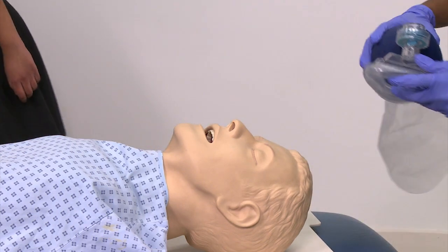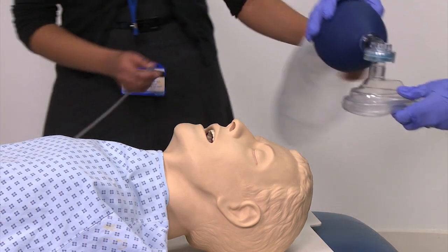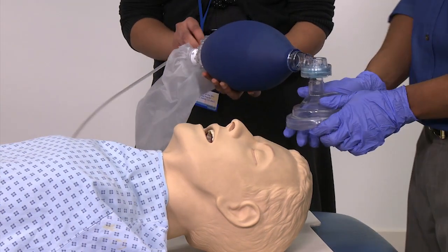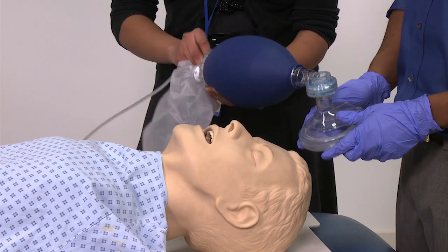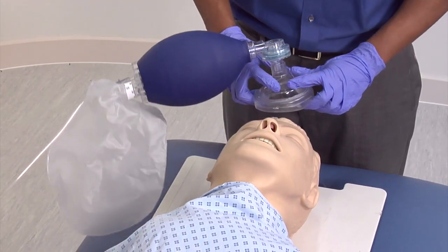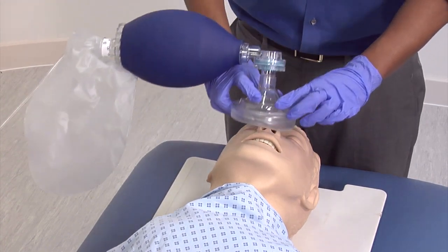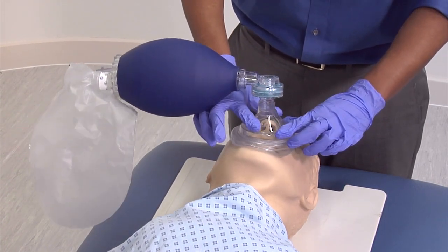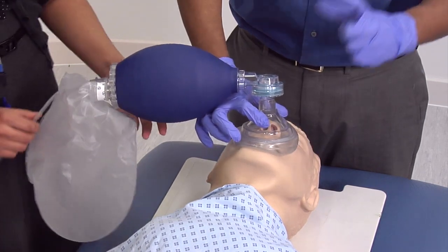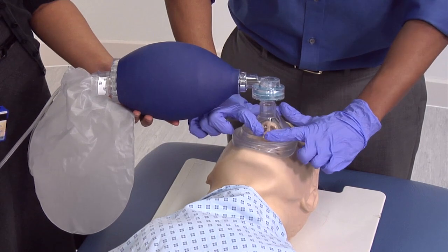Application of the bag valve mask is always a two-person technique, with one person controlling the mask and the other controlling the bag. The first clinician should approach the patient's head from behind the bed and place the mask over the patient's nose and mouth. Two opposing C shapes should be formed by the thumb and index fingers, and downward pressure applied to form a tight seal.